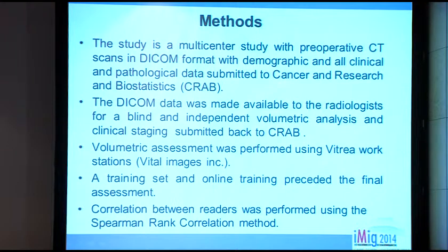This is a multi-center study with preoperative CT scans in DICOM format, including demographic, clinical and pathological data, which was submitted to CRAB by the participating institutions. The DICOM data was then made available to radiologists for a blind and independent volumetric analysis and clinical staging of these cases, which was then submitted back to CRAB. Volumetric assessment was performed using Vitrea workstations by all the radiologists. A training set and online training preceded the final assessment. Correlation between readers was performed using the Spearman rank correlation method.